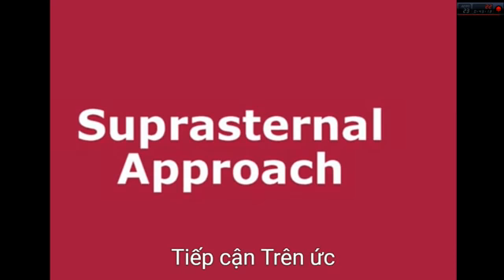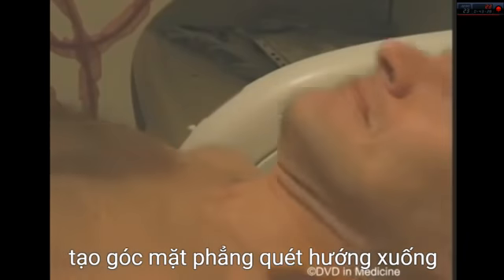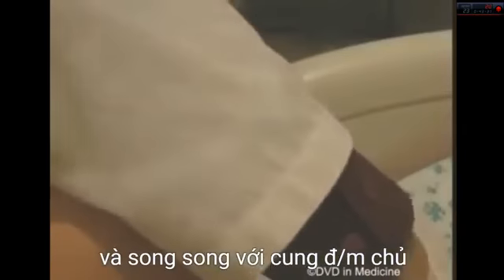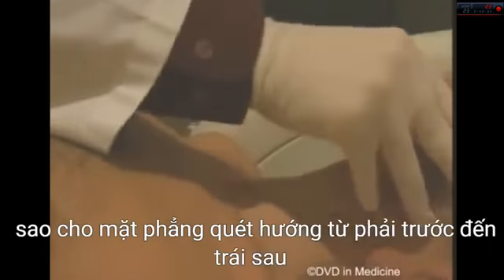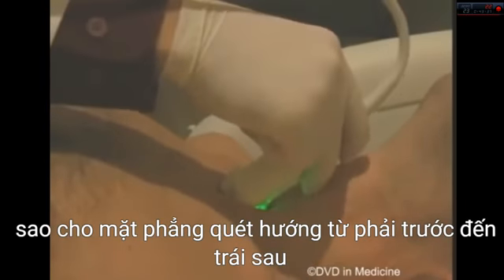Suprasternal approach. One should place the transducer in the suprasternal notch, angle the scanning plane inferiorly and parallel to the aortic arch so that the scanning plane is directed from the anterior right to the posterior left.